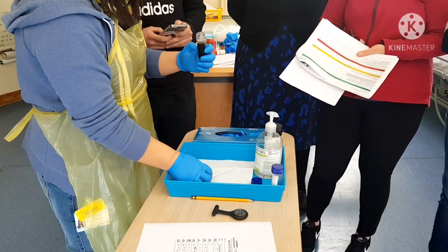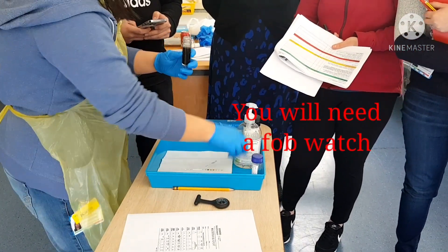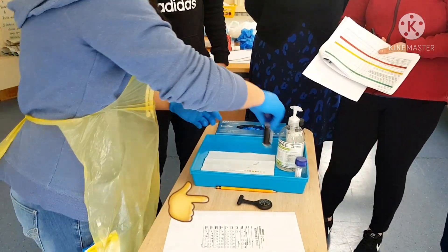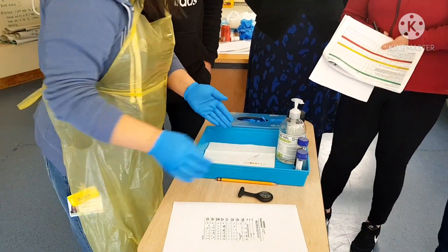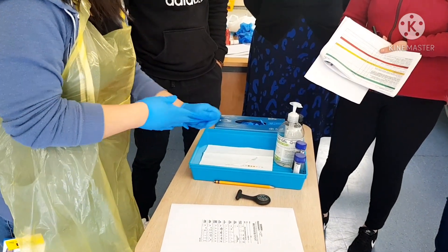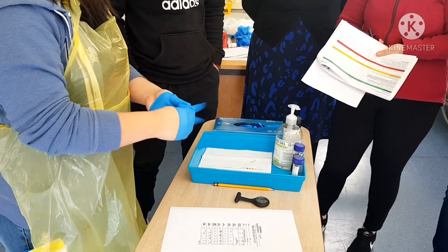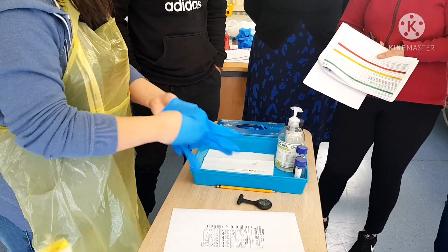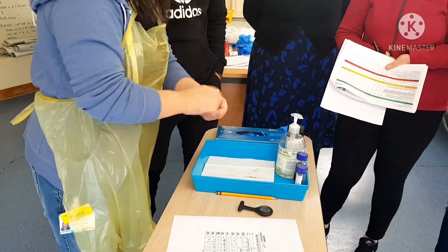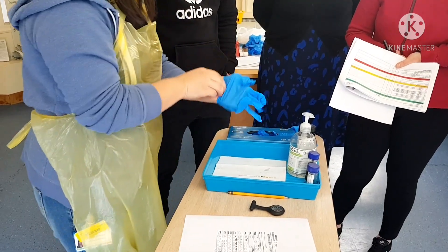I am going to dip the urine for not more than one second, making sure that all the pads are covered, and I'm going to put it on the side to get rid of excess urine. Ideally, Mr. Assessor, I should start reading the urine within 30 seconds, and within two minutes. Since glucose can be read from 30 seconds, I will start reading after 30 seconds. I can now dispose the container in the clinical waste bin, and I'm going to re-glove on my non-dominant hand.